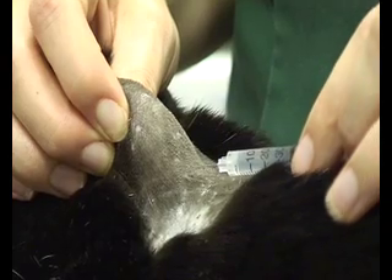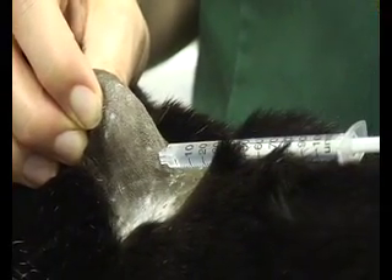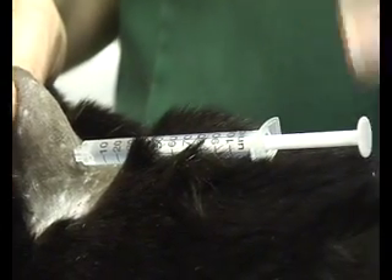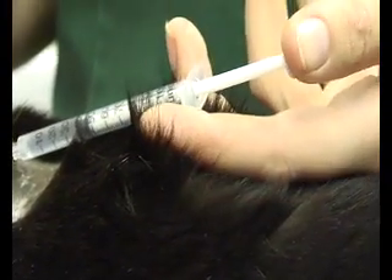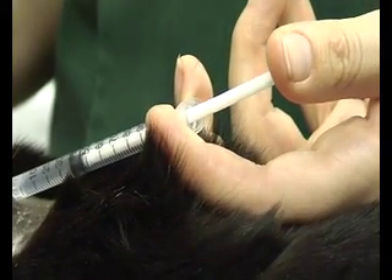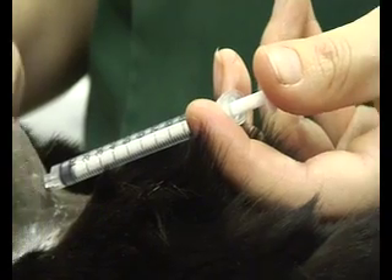Hold the needle and then gently but firmly just push it through the skin. You can see that TC didn't even flinch — that's how tiny these needles are. Then gently put your hands on the plunger and squeeze, and the insulin will go into the skin.